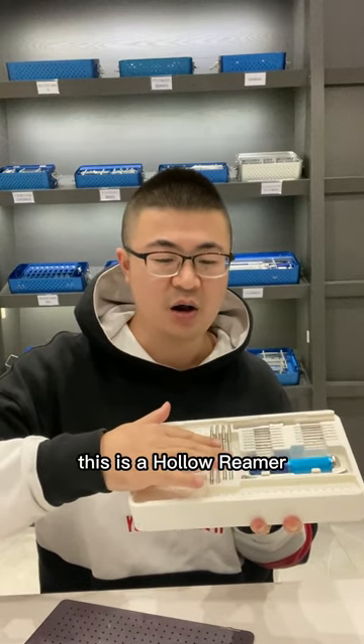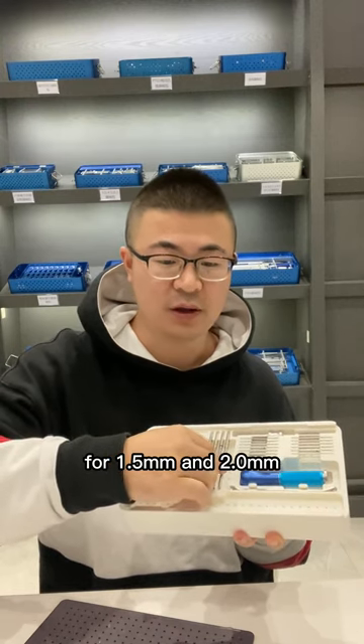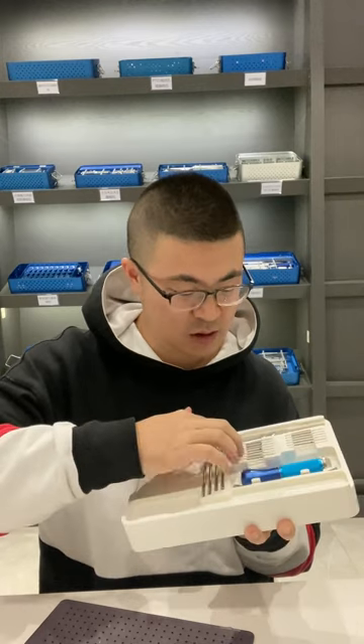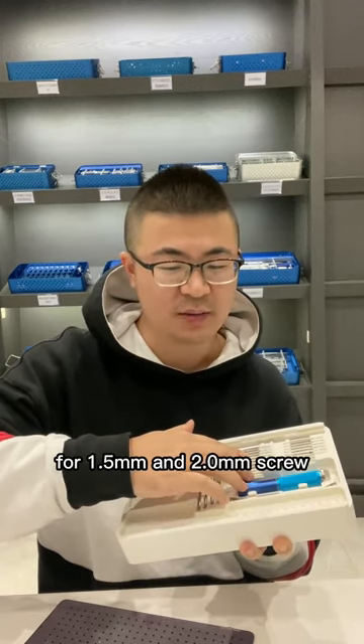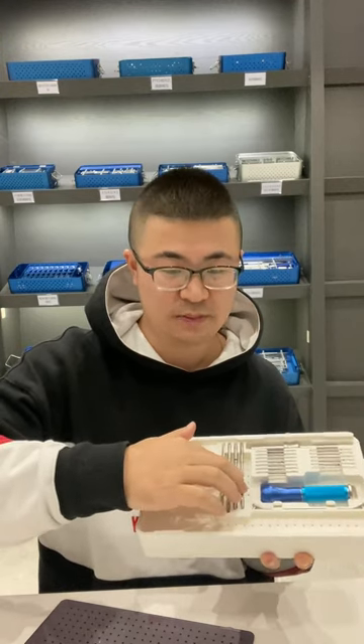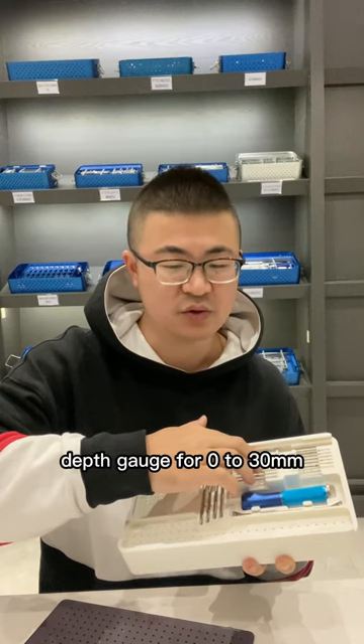This is a Hollow Reamer for 1.5mm and 2.0mm — two sizes with four pieces. And this is a screwdriver for 1.5mm and 2.0mm screws. And this is a depth gauge for 0–30mm.